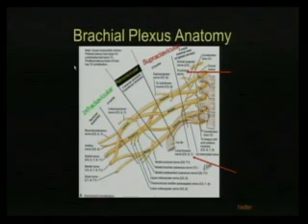So, again, just trying to drive this point home. If you're supraclavicular, you've got roots and trunks, retroclavicular divisions, and then below the clavicle, you'll have the cords and branches. Now this is the way I like to break it down based off a sagittal image. I start medial and I work my way out. I start at the source, the spinal cord, and just slowly work my way out, and I find these structures every time I read a brachial plexus study.